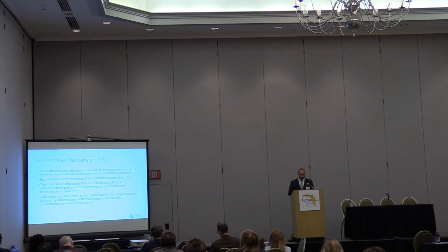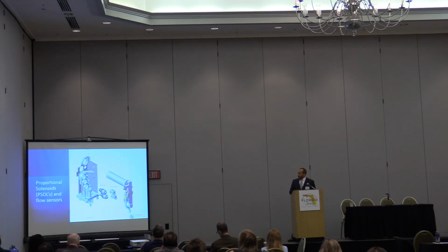It'll drastically reduce your system's downtime. These filters are designed for your patient safety and also to prevent damaging your ventilator. It's a good idea to look at maybe a 6-month preventative maintenance schedule. We'll get into that a little bit more, but it's just a nice thing to be aware of.